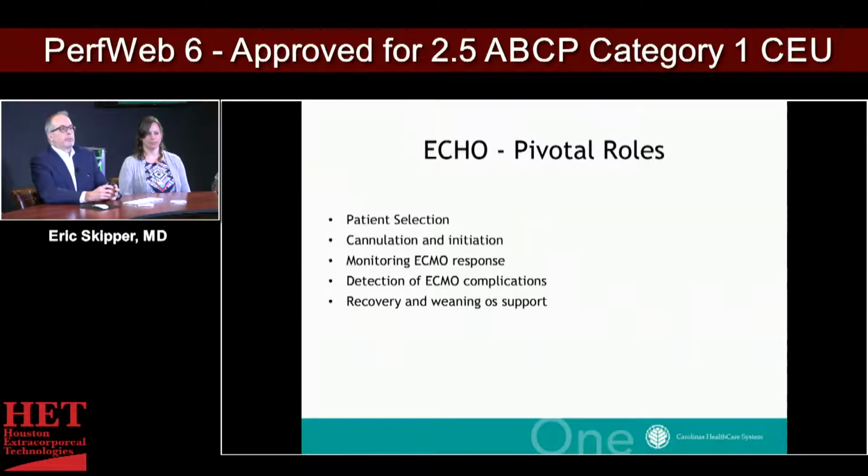Echo plays a pivotal role in ECMO. It helps with patient selection, helps guide you with regard to what you might need. Is this a primary cardiac problem? Is it a primary pulmonary problem? Which direction do we go with this patient? It helps with cannulation and initiation of flow.